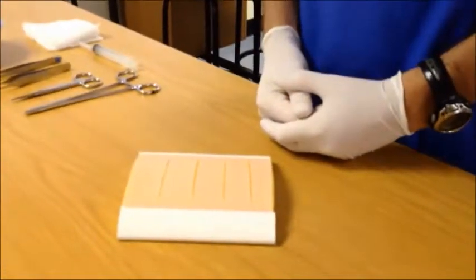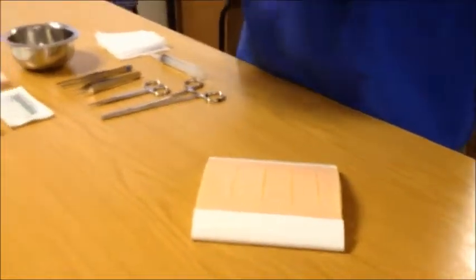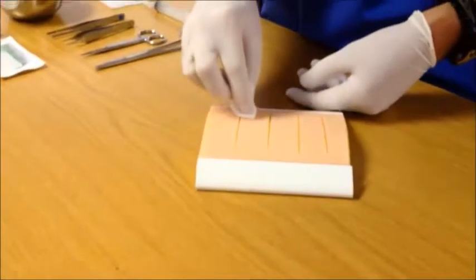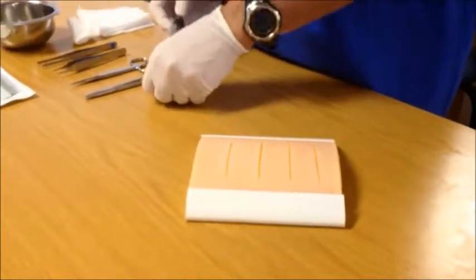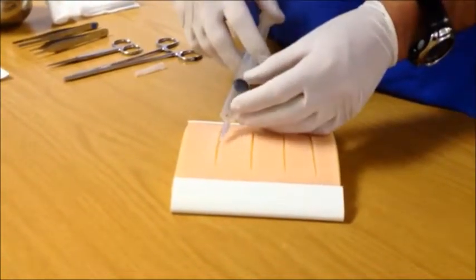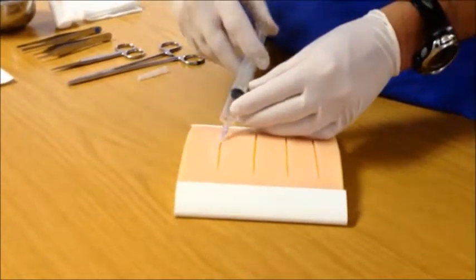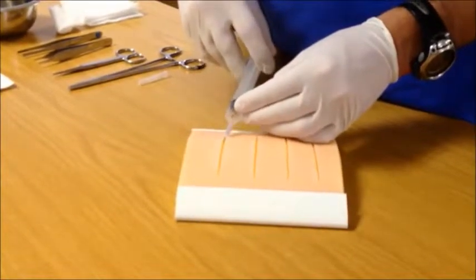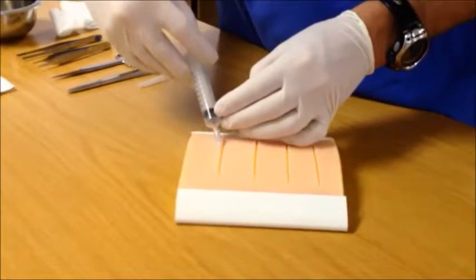After explaining the procedure to the patient, don universal precautions and proceed gently cleaning the external surface of the wound. Once this has been done, inject local anesthetic along the wound edges, approaching the wound from the wound side itself and not injecting through the skin. Make sure that the entire wound is anesthetized along both its lengths from edge to edge.